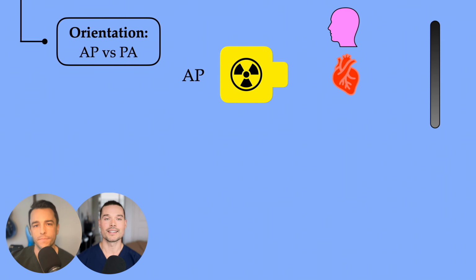We're talking about axial, coronal, and sagittal. So axial is, imagine you are looking at a patient lying down flat and you're looking at the bottom of their feet, and you're taking your x-ray vision going from the bottom of their feet all the way to their head. In this orientation, you're going to see the right side of the patient on the left of your screen, the left side of the patient on the right of your screen, the anterior portion of the patient up top, and posterior on the bottom. Again, this is a cut right down the middle, like a magician sawing someone in half.